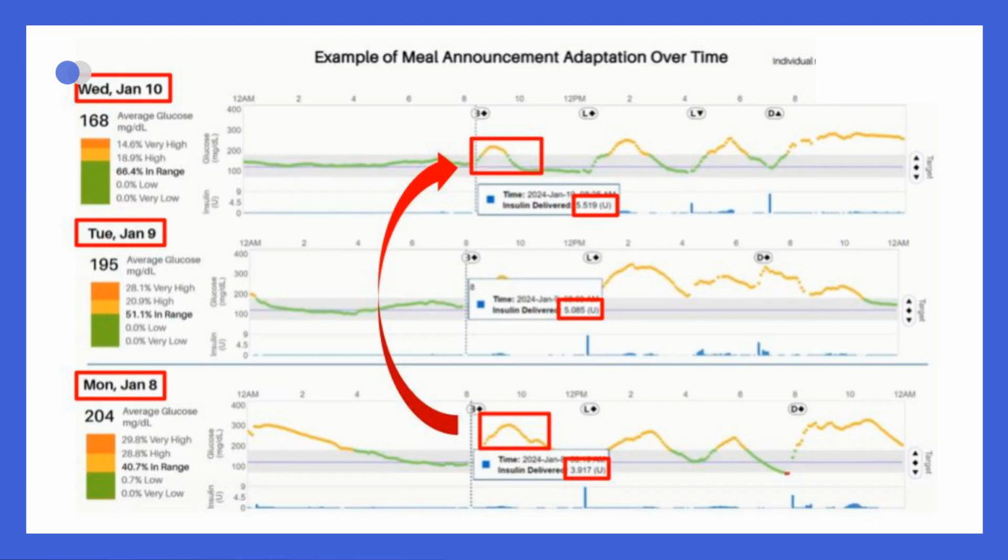postprandial glucose levels. Meal dose adaptation only occurs if no meal announcements occurred within the 4-hour adaptation window, and if the glucose levels at the beginning and at the end of this 4-hour window are less than 80 mg per deciliter or 4.4 millimoles per liter above the glucose target. After a sensor glucose value drops below 60 mg per deciliter, the bolus algorithm suspends insulin dosing for hyperglycemia correction for 1 hour with reduced doses for 30 minutes to prevent overcorrection.